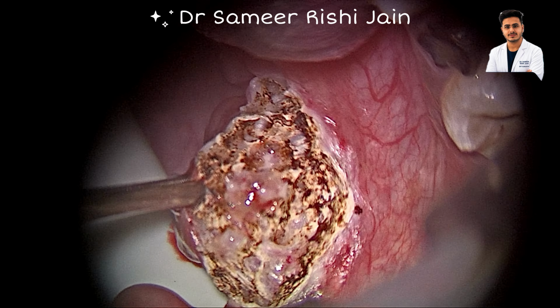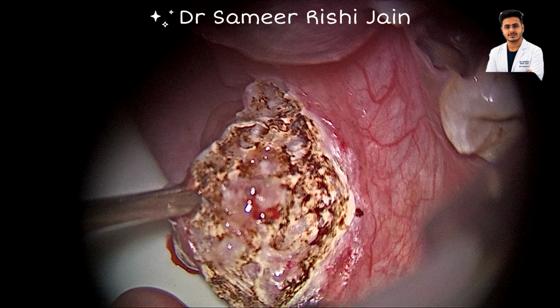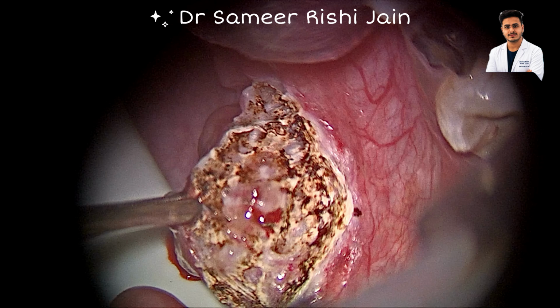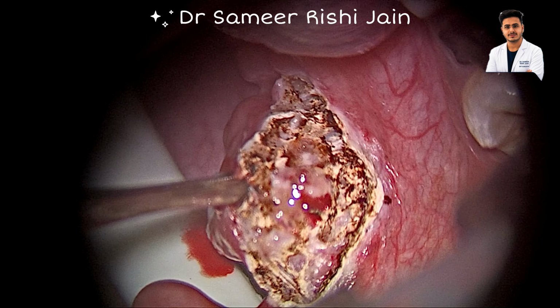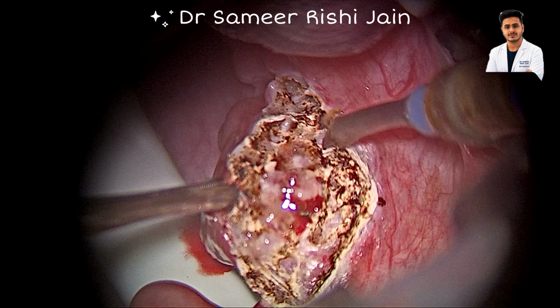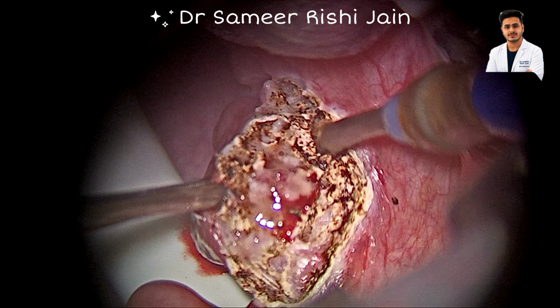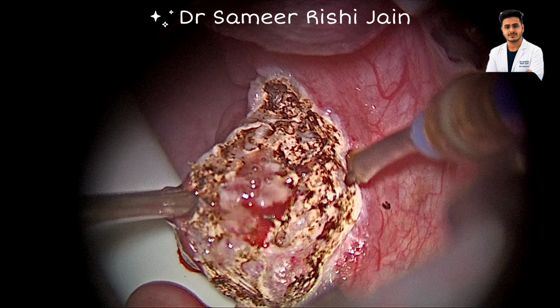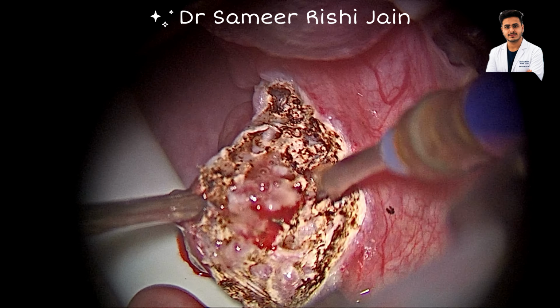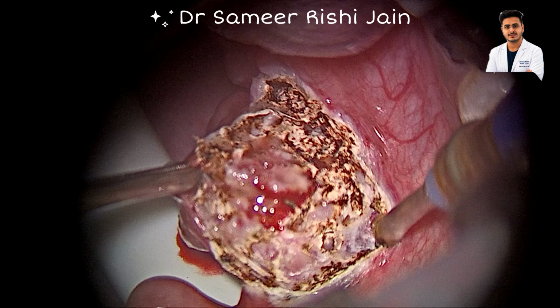As this is a chronic tonsillitis, we can see the pus coming out of the tonsil, and when the pus comes out of the tonsil, it indicates that we are going into the tonsillar tissue. We don't have to go into the tissue; we have to stay lateral to the tonsillar tissue and medial to the tonsillar bed. You have to give good traction and counter traction so that the tissue differentiation becomes good.